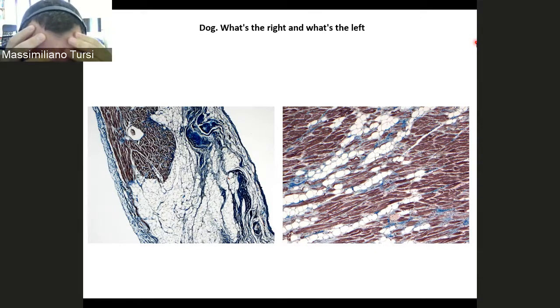That's a very nice question, because toxics usually induce degenerative process and necrosis. And so what do we see in the histological examination in this case? It depends on the timing, because in the beginning of the toxic effect we see degeneration, not so specific, maybe vacuolar degeneration of the sarcoplasm, and necrosis.